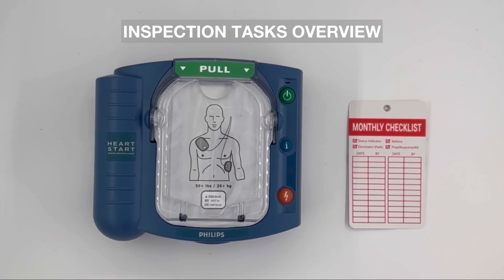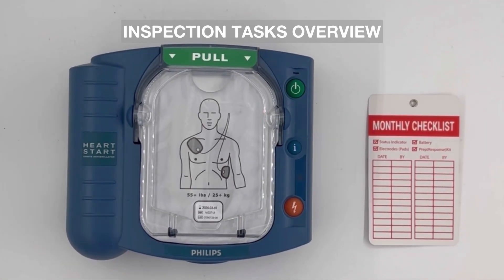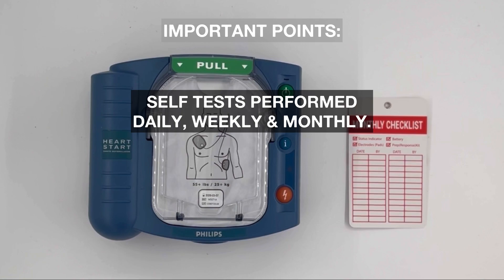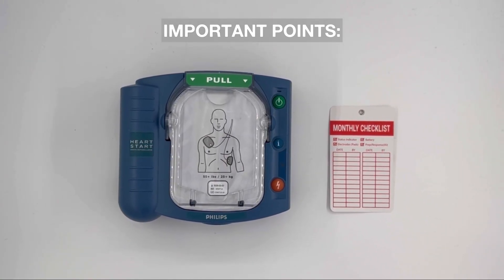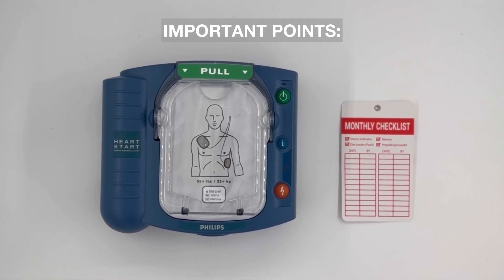The key inspection tasks include checking the ready light indicator and ensuring the electrode pads and batteries are not expired. This AED performs self-tests daily, weekly, and monthly. The status indicator allows you to quickly see if the unit has passed its last self-test and is ready for use, or if there is a problem.